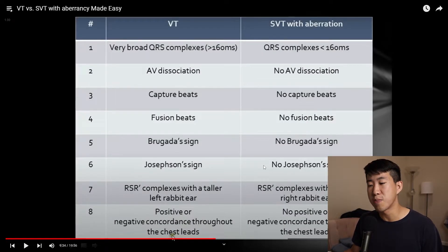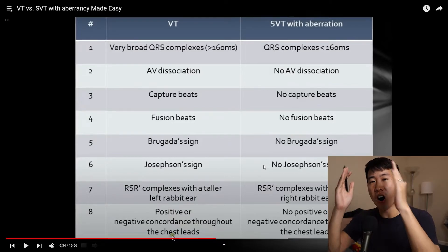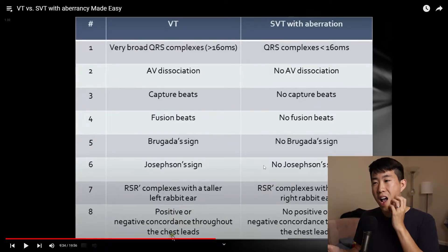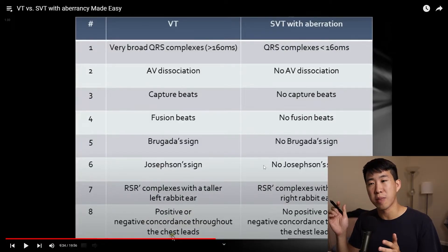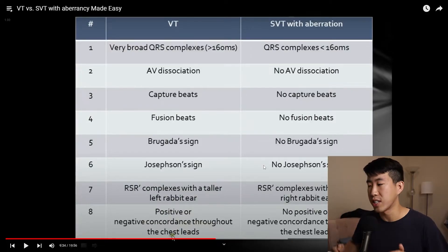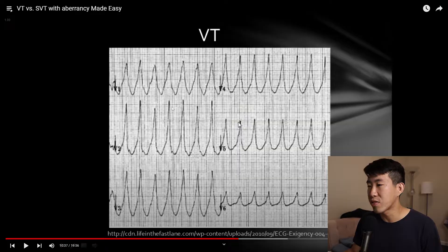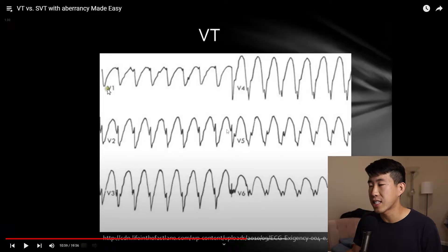The next thing to look for is positive or negative concordance throughout the precordial chest leads. This means all complexes from V1 through V6 are all going upward or all going downward — no RS complexes where the QRS goes up and then down. If you see concordance, whether positive or negative, that's basically diagnostic for VT rather than SVT. Here's an example of positive concordance where everything is upgoing, and here's negative concordance where all QRS complexes are purely downgoing throughout all the chest leads.